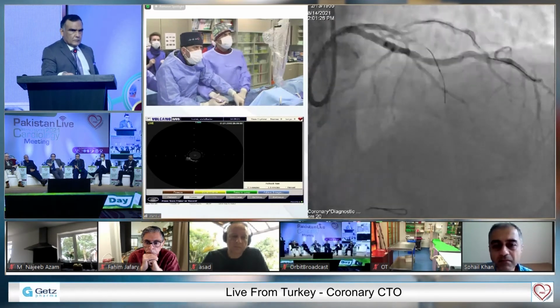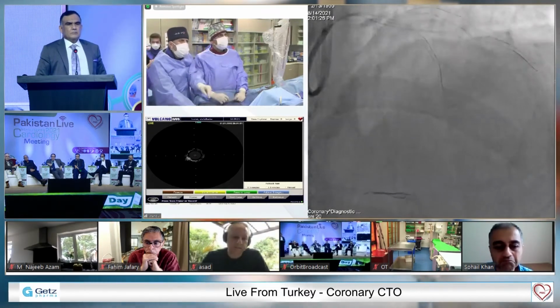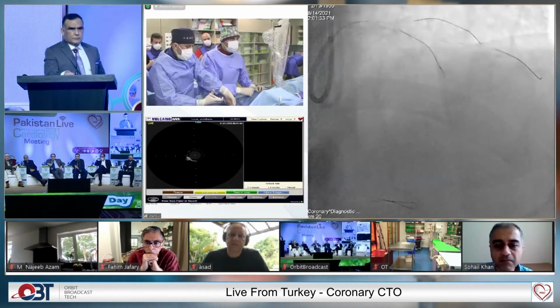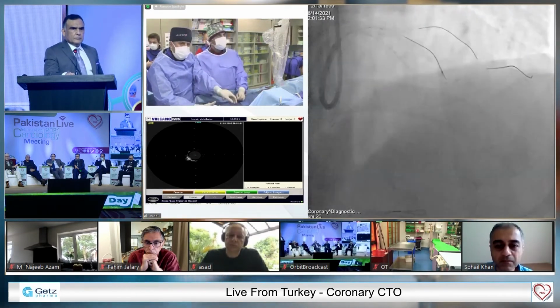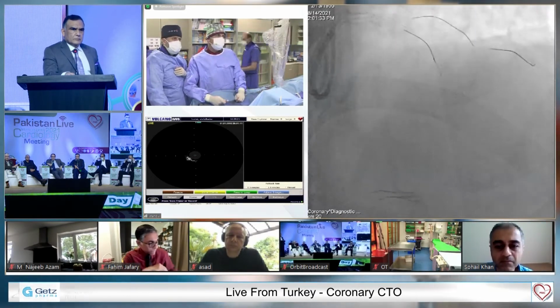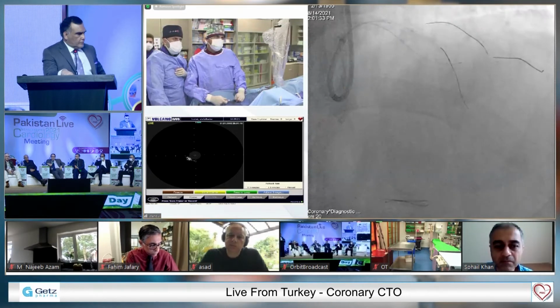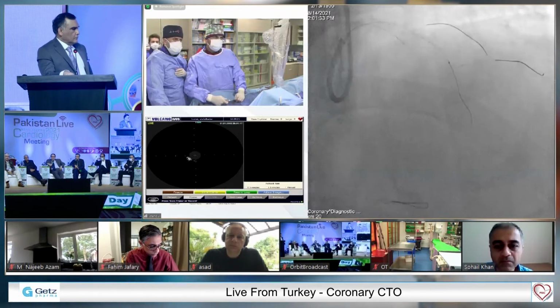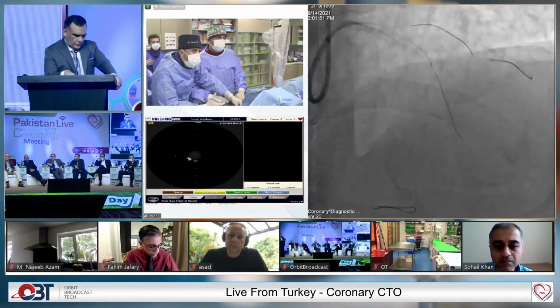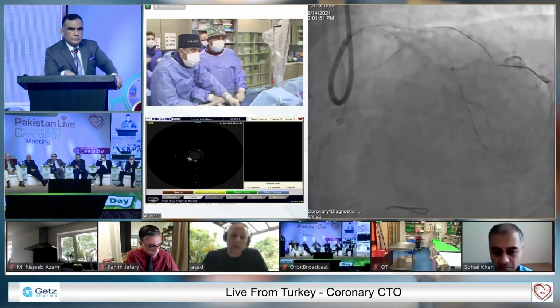I'm not happy at all with the course of my wire. I'm not happy as well. Let's leave my wire somewhere here and go retrograde. If you have microchannels, Fielder XT might be a good choice, but I don't see a lot of microchannels here. So probably Gaia is not a bad choice to penetrate.